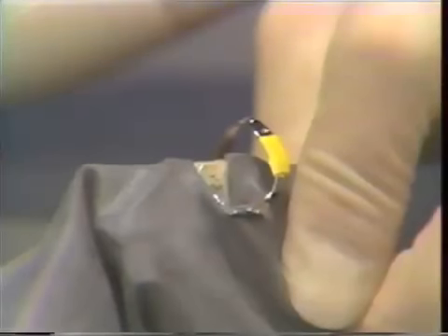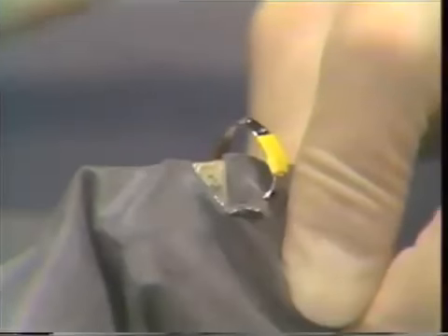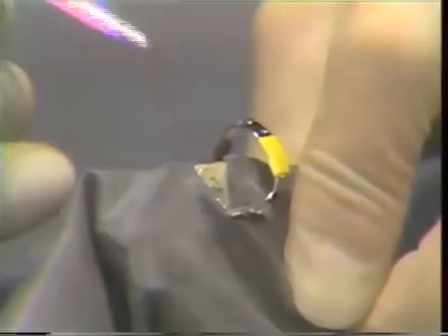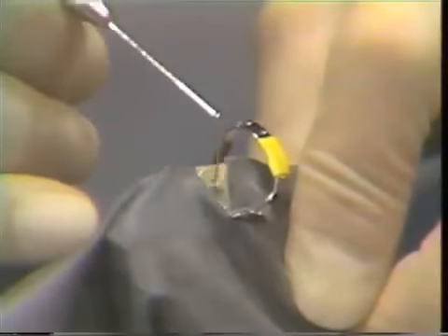Mandibular anterior and bicuspid teeth are similar in that they usually have one canal leading directly off of the pulp chamber. However, both mandibular anterior and bicuspid teeth have a tendency to have 2 canals, and you have to check each tooth to make sure that it does have only one canal. You do this by coming in at different angles and looking for a second canal.